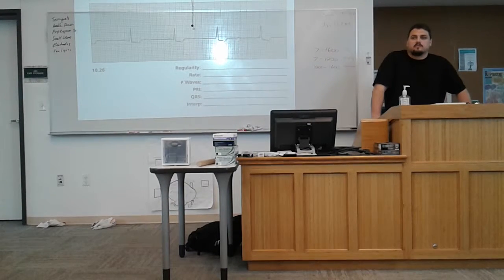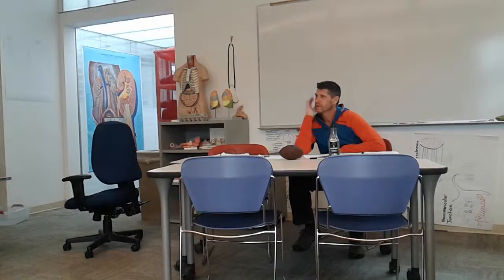But he just said ST depression. You just said that's wrong. No, that's right. I just think just put it at the end. Okay. The third degree heart block with ST depression, flipped T wave, and a junctional focus, a junctional escape focus versus a ventricular escape focus. Right? A junctional escape focus?